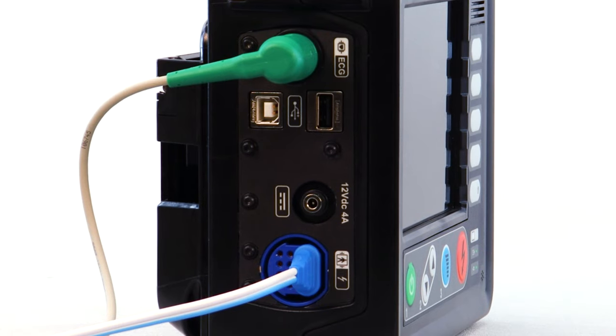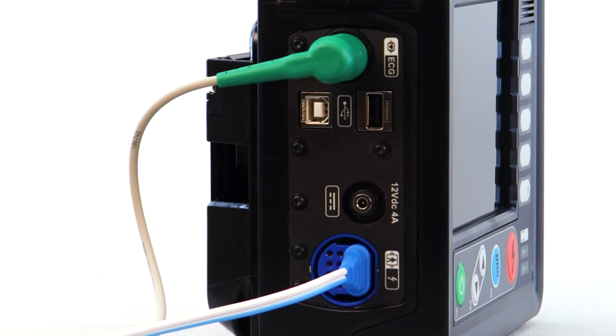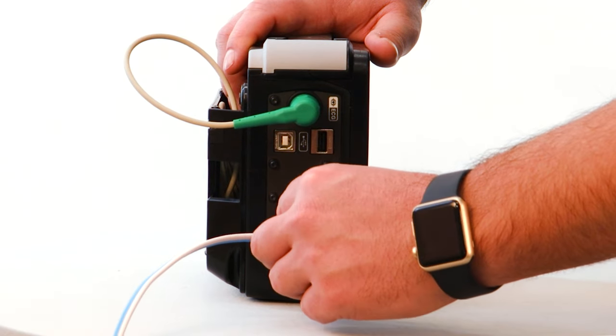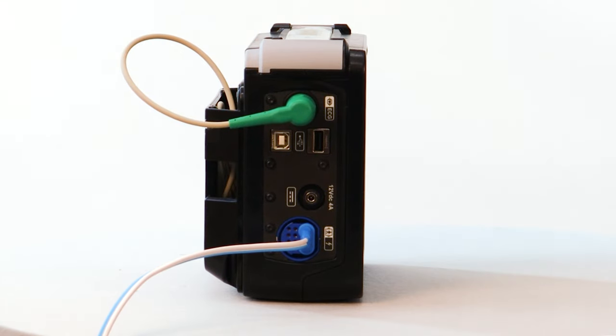The Tempest LS does not use a traditional therapy cable. Instead, the six-foot-long pads connector is inserted directly into the Tempest LS. The LS is programmed to recognize the difference between pediatric or adult pads and can adjust the customizable default energy setting accordingly.